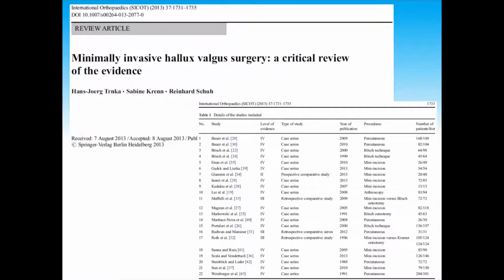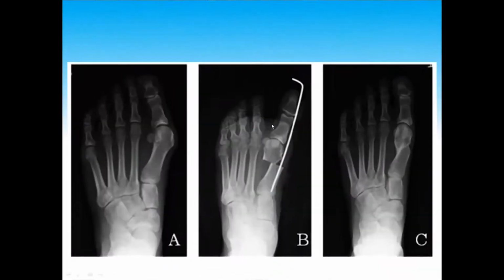Minimally invasive hallux valgus surgery. There have been many authors. It's been around for quite a while as far as the MIS technique for this bunion correction. And this is the typical approach where the MIS procedure was done by cutting the bone, shifting the bone, either with a burr or a saw, and then it was just pinned, relatively stable, not ultimately stable. The capsule was kind of shish kebabbed with the pin, and the pin was external.